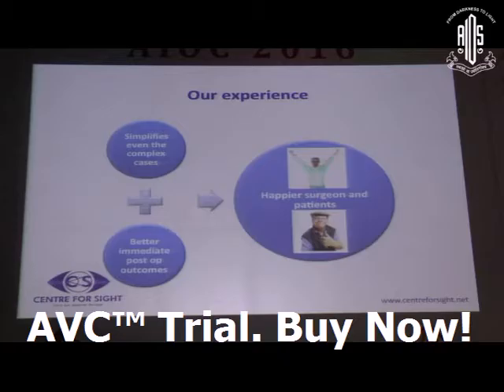Now, one thing for you to remember is that if you have a white mature cataract, nothing of femto is going to work, as regards the nucleotomy. You will have a fantastic capsulotomy, you can have the incisions, but because you don't have a transparent medium through which the femto can go down and focus, it cannot cut a white cataract. So for a white cataract, you could put the nucleotomy off because it is not going to cut it.